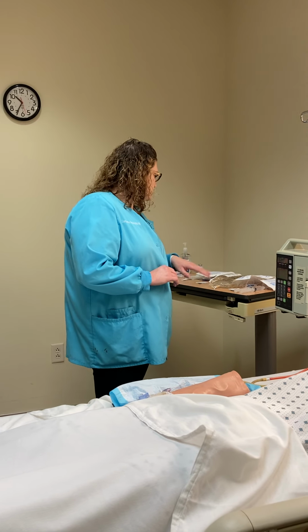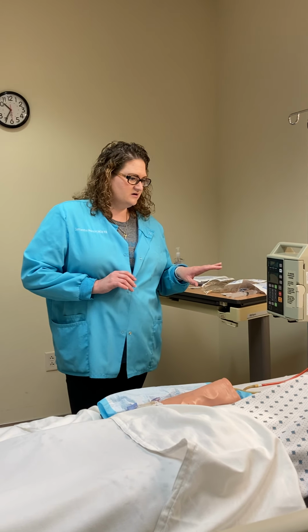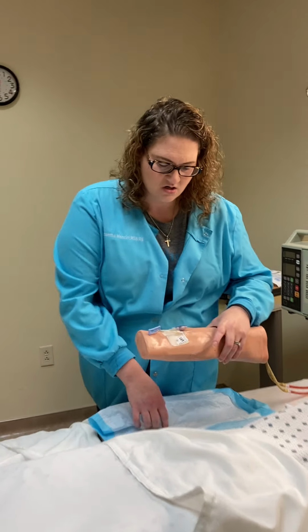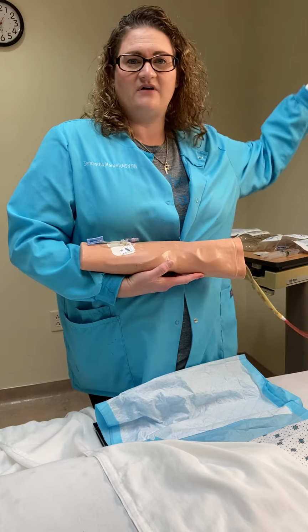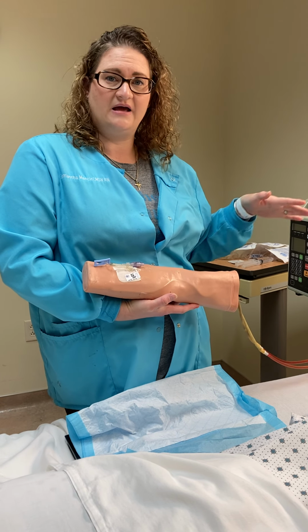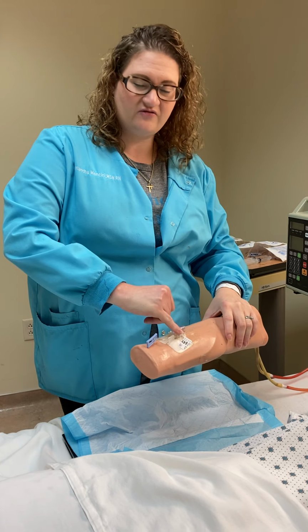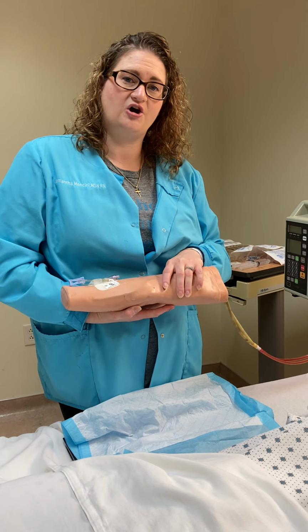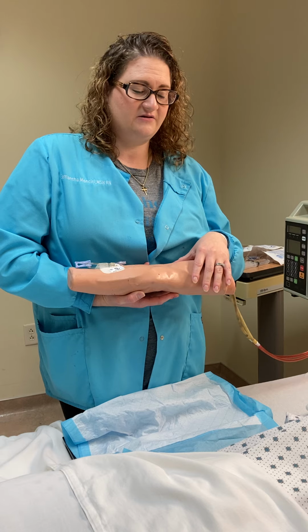Complications. So some things that we are looking for when we're assessing our patient. If we have IV lines, we want to make sure that it's connected up to the proper line. So we want to trace from our point of insertion back to make sure it's going where it needs to go.